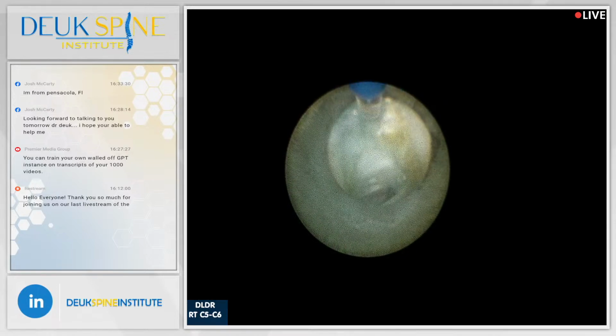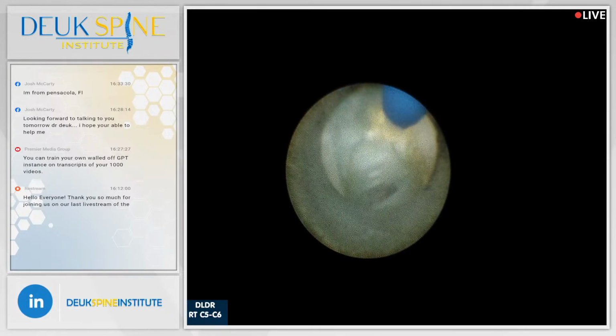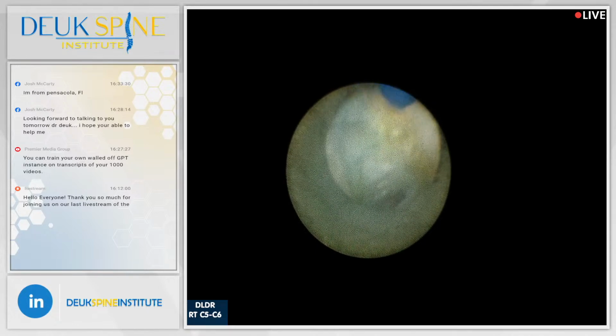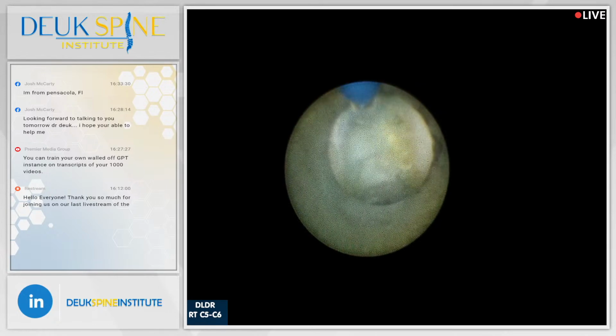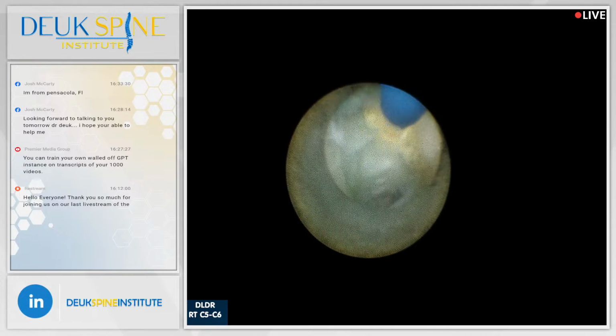This is the other side we're going on the disc. Remember, we saw the dye leaking out bilaterally, and that's where the dye leaked out, by the way. That tear right there. Now, that tear will heal itself. Now that we've gotten rid of the herniation that was there, that will heal itself. He just needs some time to heal.